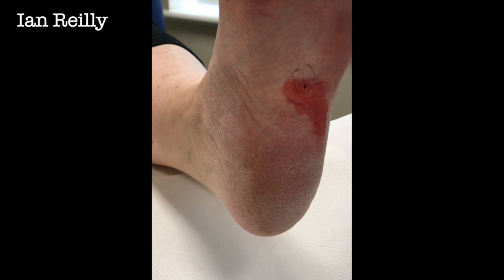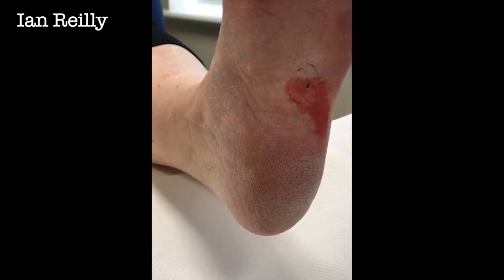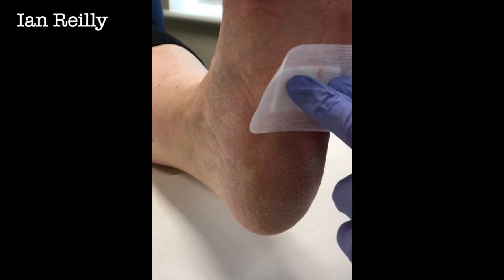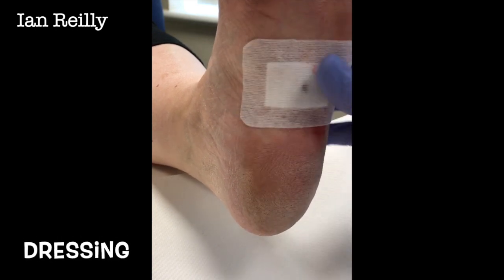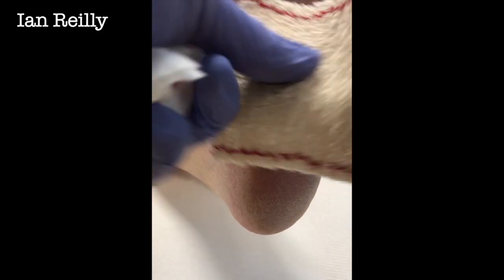And a dressing, we're done. And that's it, Lisa. So we send that away. That's probably going to come back as a verruca. But I just want to check that it's not doing anything it shouldn't. I don't for a minute think it does, but I'm a fusser. Little tiny bandage on, and that's us done. And I'm just going to put a bit more dressing on that. That's it done. Thank you, Lisa.